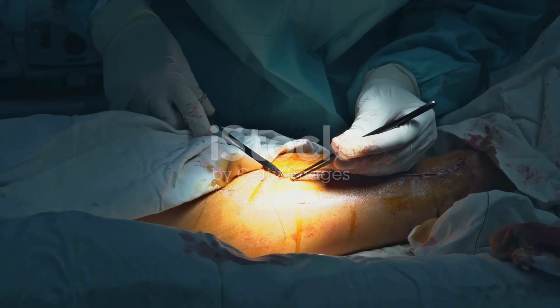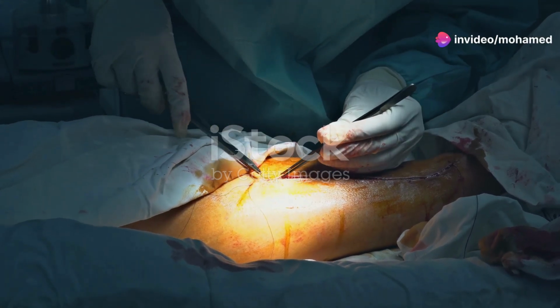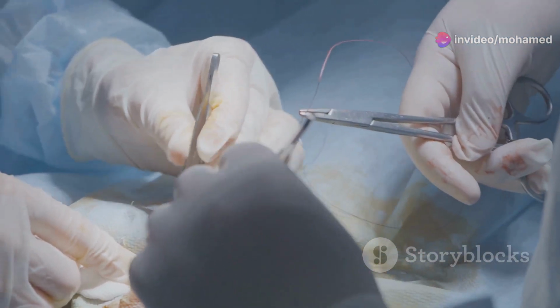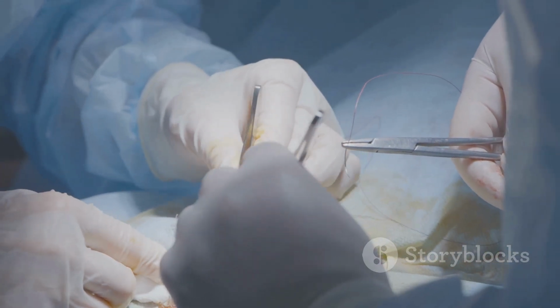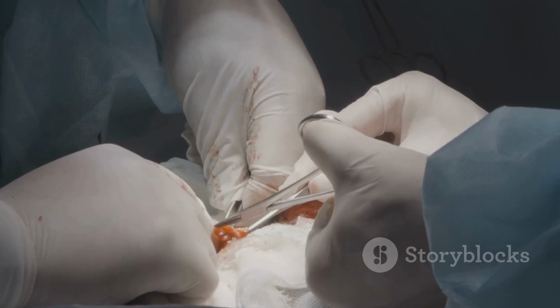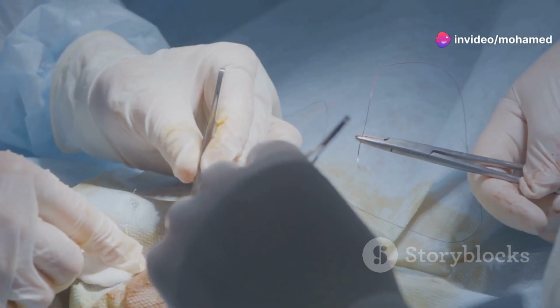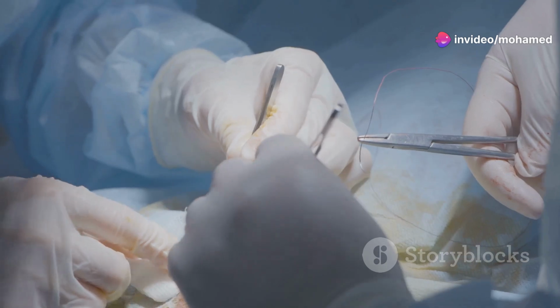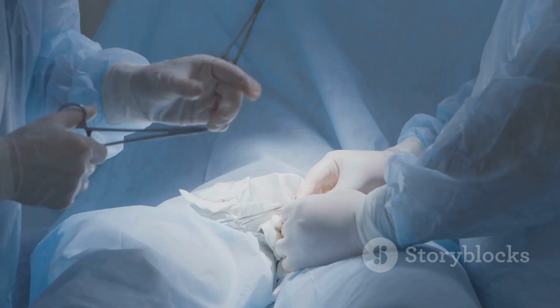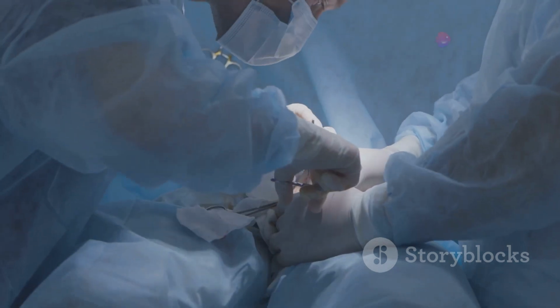First up, we've got absorbable sutures. These are designed to be temporary, providing support to healing tissues before they naturally dissolve. These are made from materials that naturally dissolve in the body over time. This means they don't require a follow-up procedure for removal, which can be a significant advantage in many surgical scenarios. Types include catgut, polyglycolic acid, and polydioxanone. Each of these materials has unique properties that make them suitable for different types of tissues and healing processes.